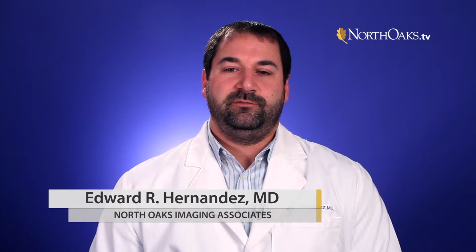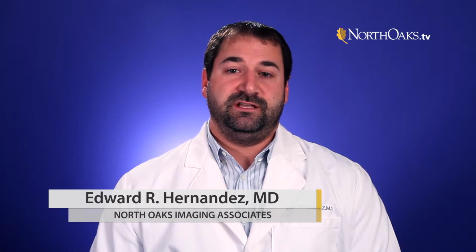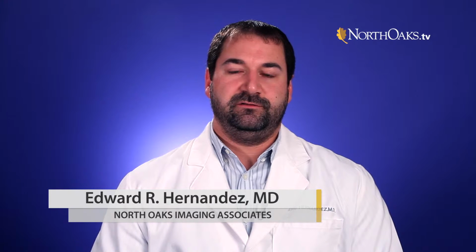There's several different types of imaging for the breast, including mammography, ultrasound, and MRI. Digital mammography is the most common form of breast imaging, and it uses low-dose X-rays to take images of the breast. Screening mammography is obtained of patients that have no symptoms and is performed on an annual basis.